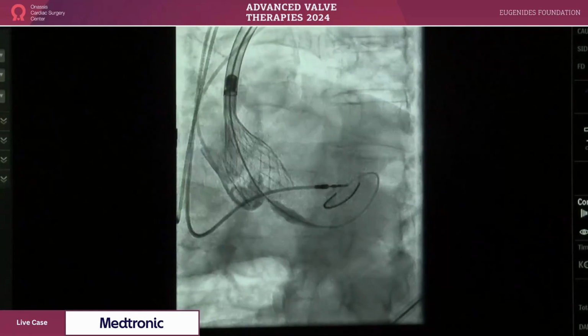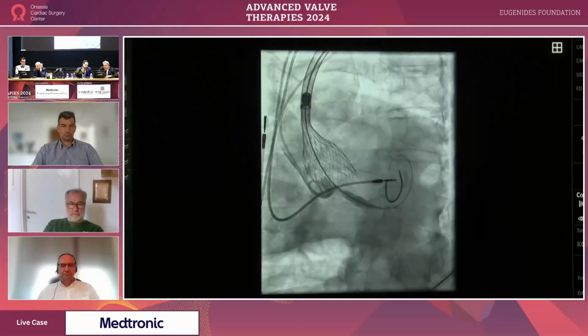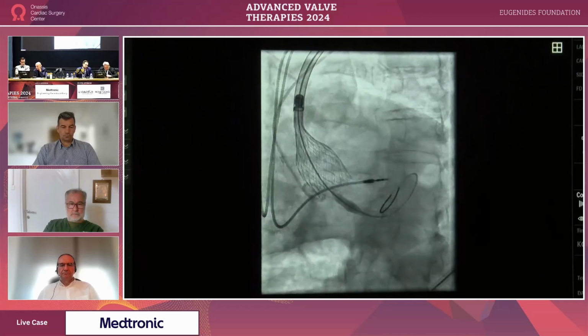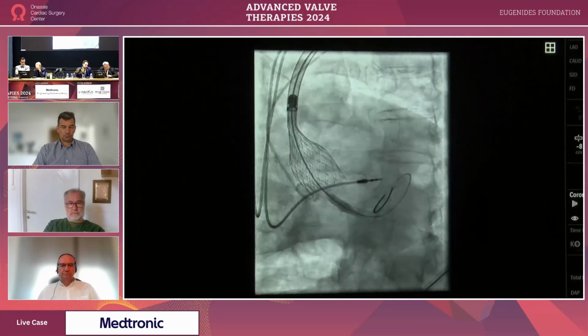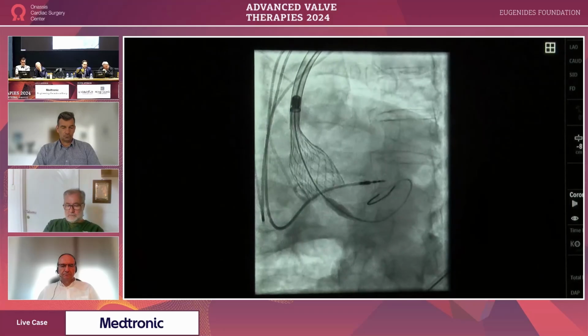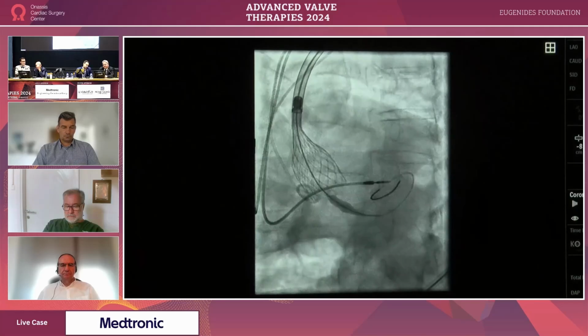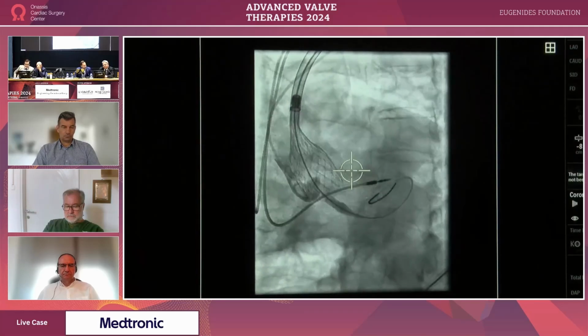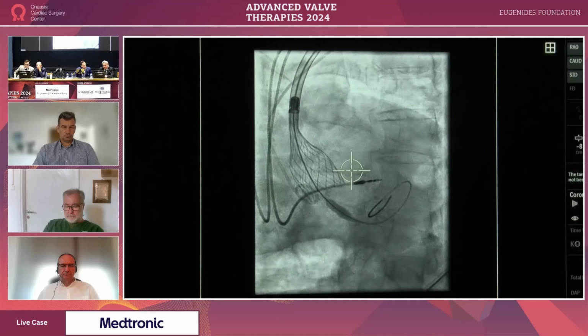Yannis, the only question is how important it is to implant it high in this patient. Yeah, so there's no actual reason, I think. If it's just in order to show that you're good, it's too high. Don't do that. So yeah, that's why we discuss. So maybe we can place it a little bit lower. Yeah, I agree, probably. Can we go cusp overlap?